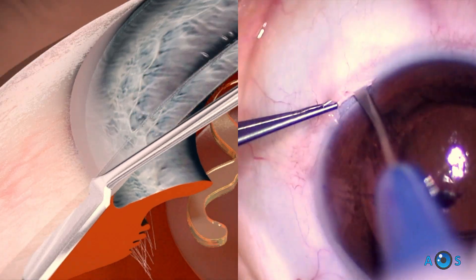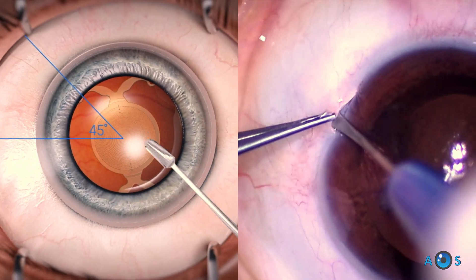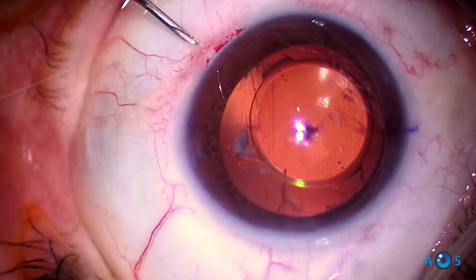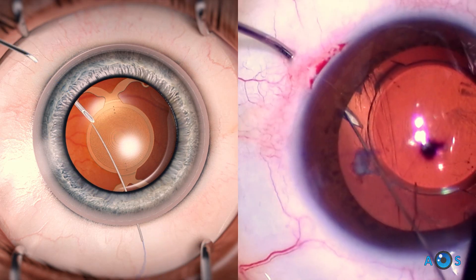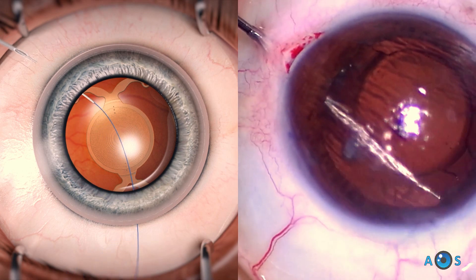Progressive IOL tilt and decentration led us to start performing a Hoffman pocket at the temporal inferior side. The scleral pocket lies at 45 degrees, which is the axis that the toric IOL was originally intended to be placed at.